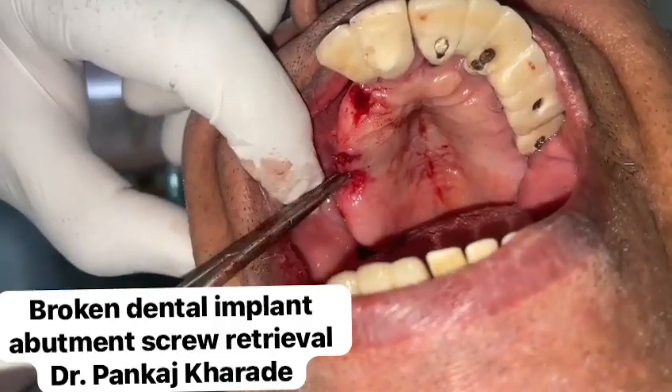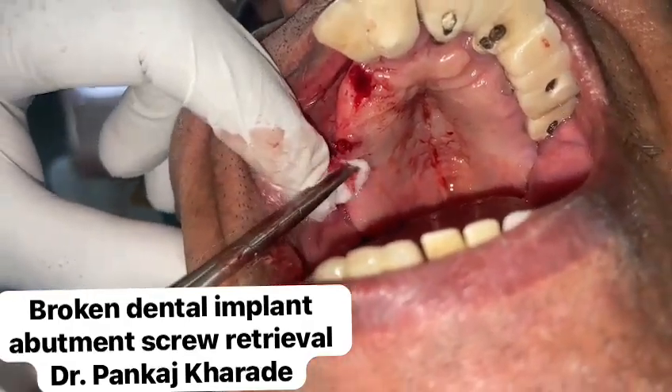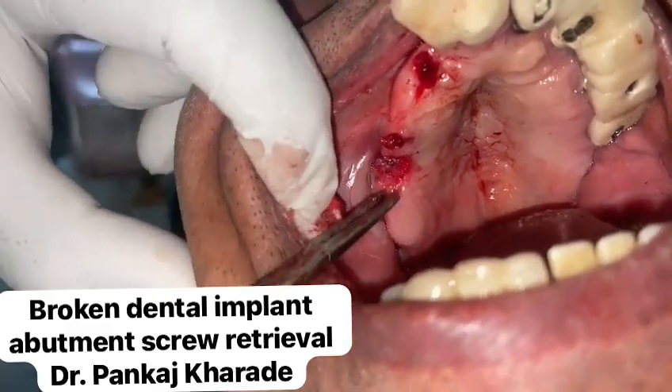Dental implant screw loosening and fracture complications can be as high as 45% over a 10-year period. Once a screw has fractured, it can be challenging to remove it from the implant chamber.